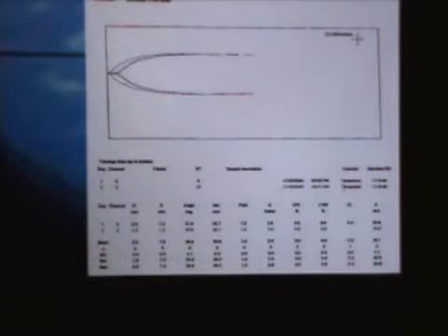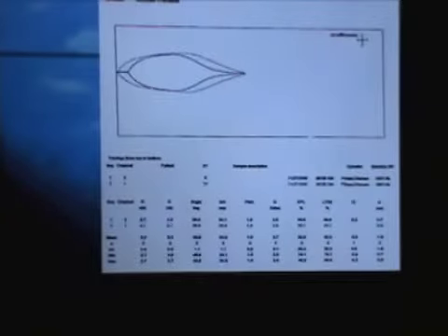The anesthesiologist in cardiac surgery, they use the rapid TEG for their on bypass run and their post-protamine runs. That's where they use it. Okay? Trauma, they use it all the time in trauma. In fact, that's where we did most of our data collection was in trauma. This here is a primary fibrinolysis case, and again, it shows it.